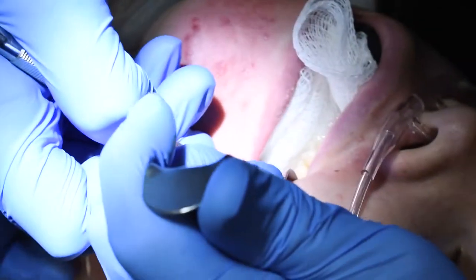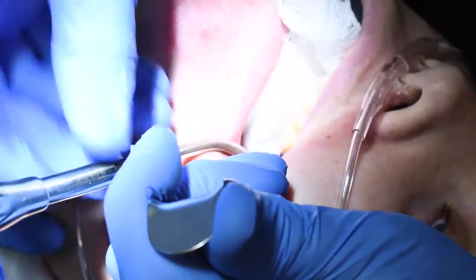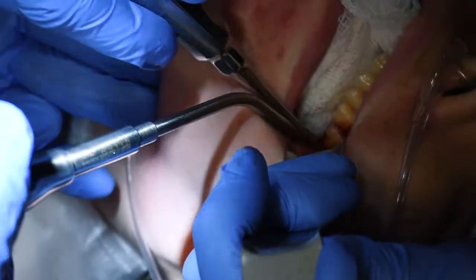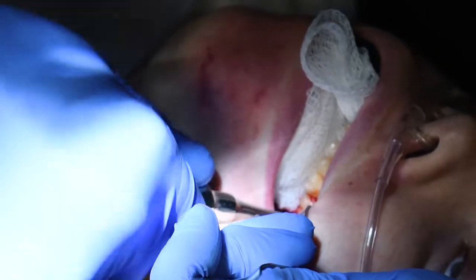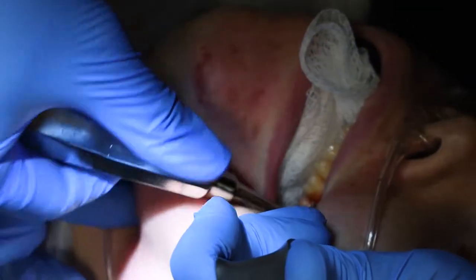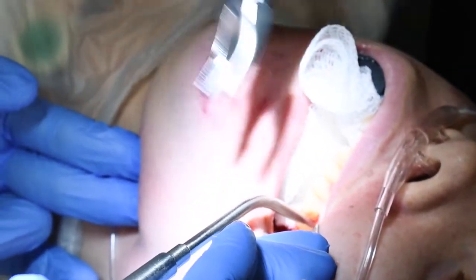I've got to raise this tissue out of the way — that's what this periosteal instrument does. With the tissue out of the way, I can start to see the tooth right there. This fancy little instrument, which might remind you of the ice pick from Basic Instinct but is not — it's called a straight elevator. I elevate this thing and the tooth comes out to say hello.